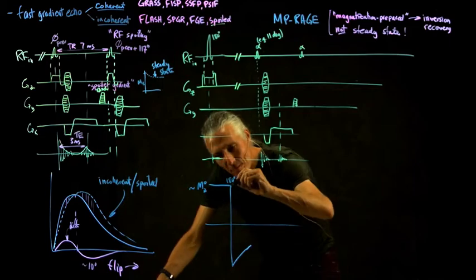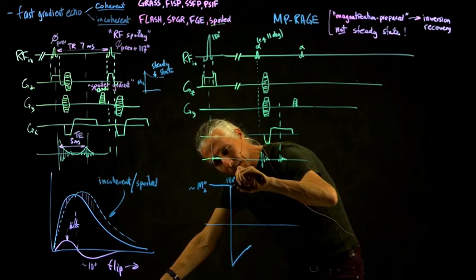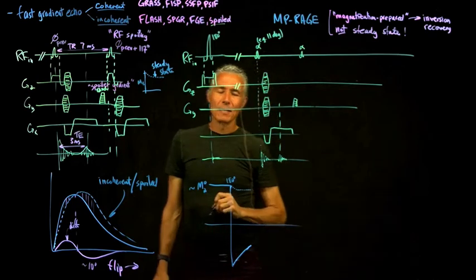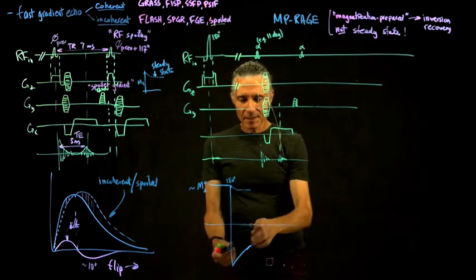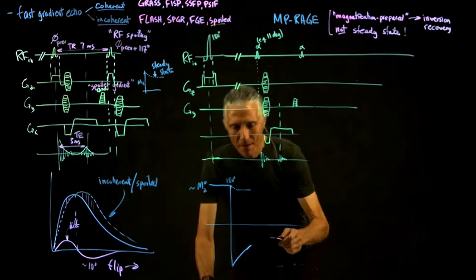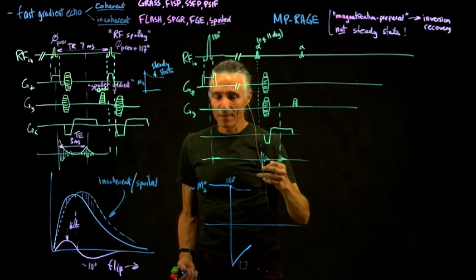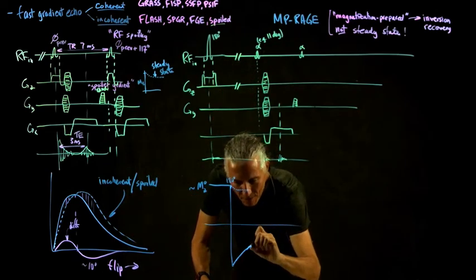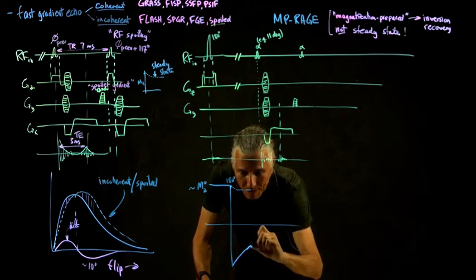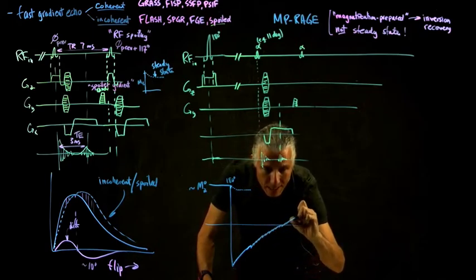Compare that with the steady state. In the steady state, we would have done a whole bunch of RF pulses, and we would have reached a steady state almost as big as MZ0. But this is radically not steady state. So we go down to negative MZ0, and then we start doing all these alpha pulses, maybe 100 of them. There's a little alpha pulse, we flip a little bit, and then there's recovery. So there's a whole series of jagged alpha pulses like that as it crosses 0.